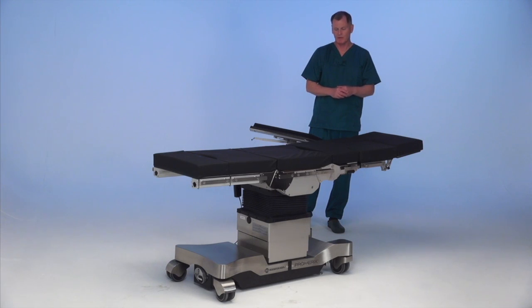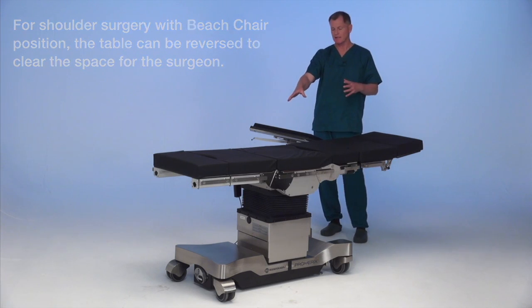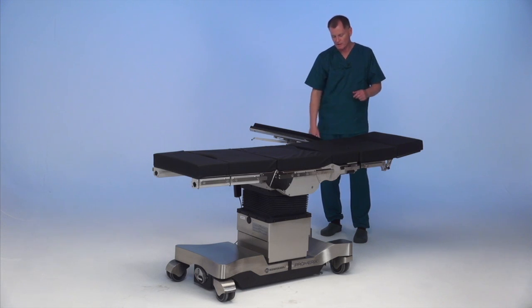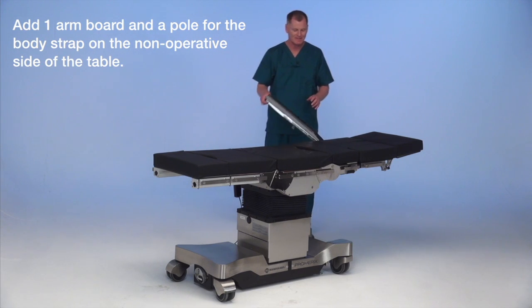Shoulder surgery with the beach chair setup: the beach chair device table is reversed. What would normally be the head section of the base is facing in the foot direction, and the normal foot direction is under the head area. The reason is to clear space for the surgeon — less table underneath the shoulder area where we're going to be working. One arm board is on the table, a planing-type arm board.